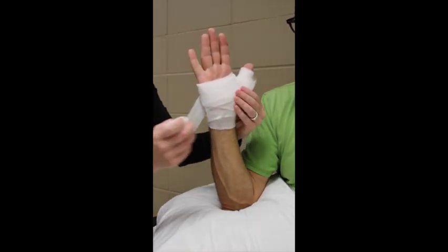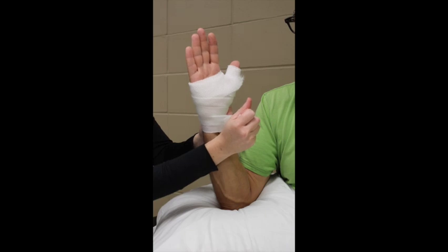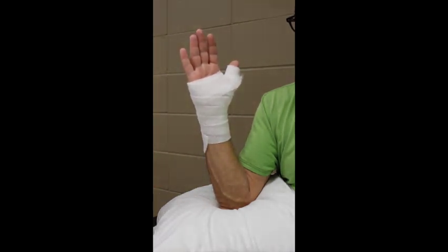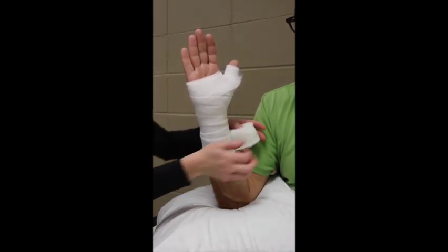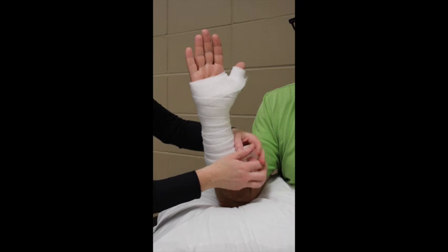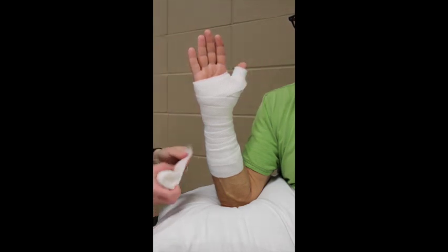Overlap by 50%, making sure to cover that area where the splint may rub. There should be no tension in the padding — simply lay the padding down onto the skin. As you get about halfway down the forearm, choose an ending point and wrap around three to four times. The forearm piece is just a support or base for the thumb spica.